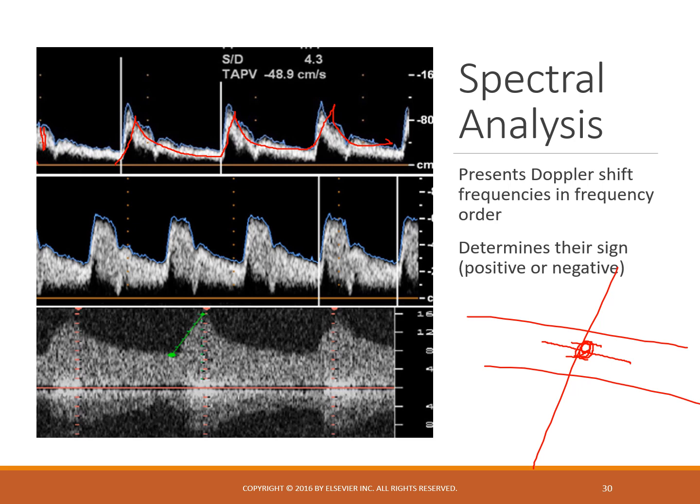Now, if we go over here, and I know I'm cutting this off a little bit, we have 160 as my peak. At this particular moment in time within that sample, it picked up velocities ranging from negative something, so going reversed, to positive 160. So this tells me I have forward motion up to a really high velocity, but I also have some reversal.